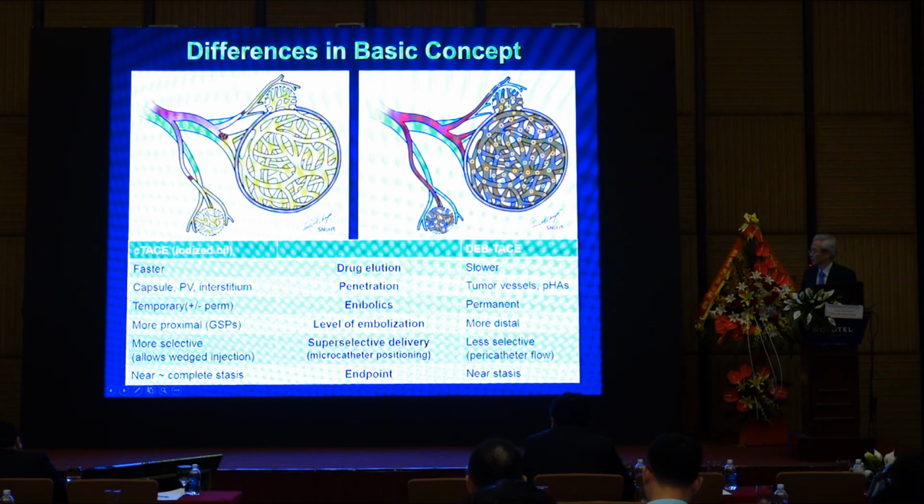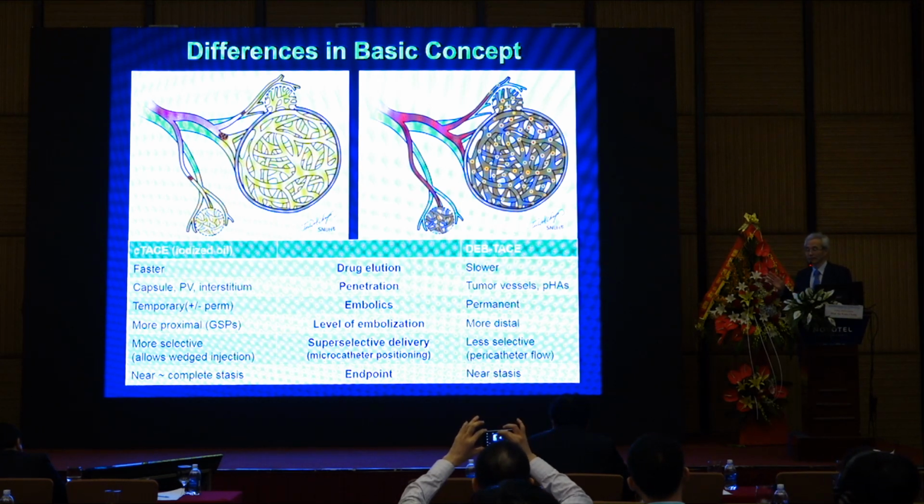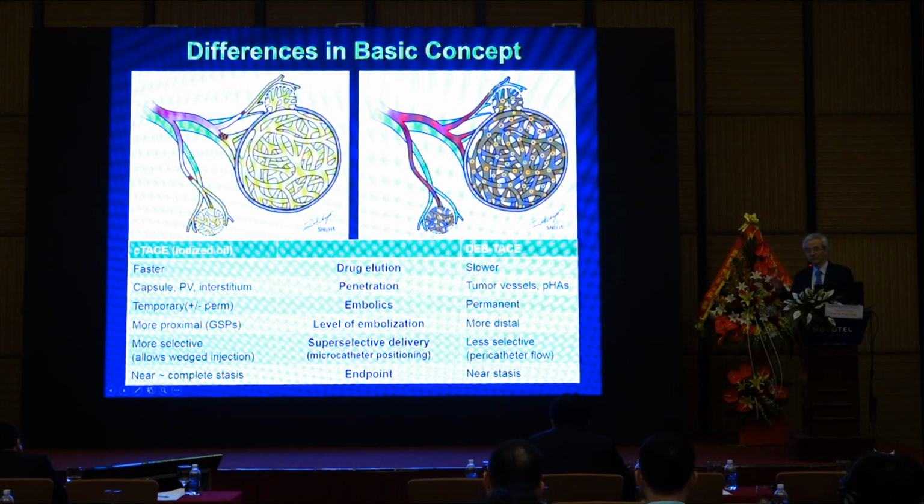How about the quality of embolization? Basically, DEB-TACE is a permanent embolic material, but in conventional TACE, we usually use gel foam so that it can be transient. If you use very tight embolization with the gel foam, it can be permanent.